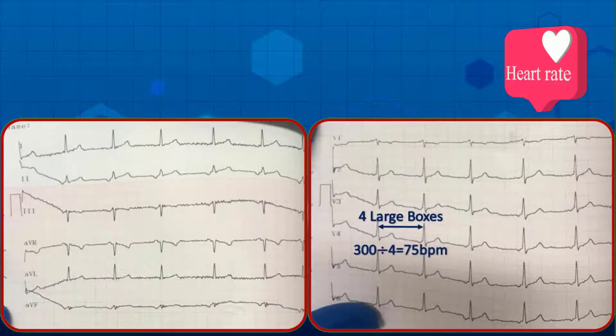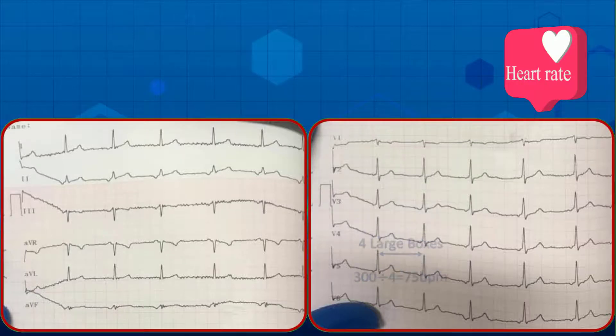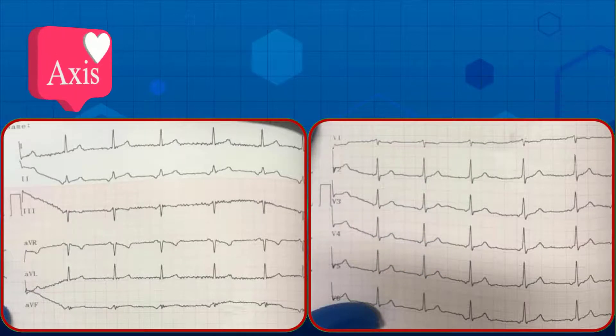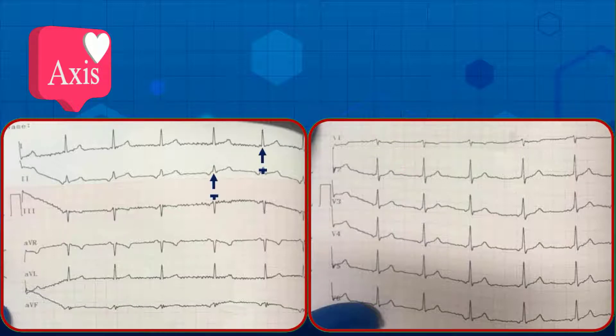Third: calculate the heart rate. The RR interval is approximately 4 large boxes, so the heart rate is 75 beats per minute.